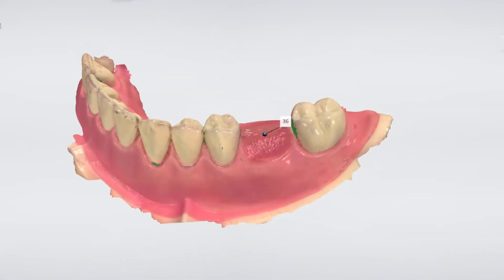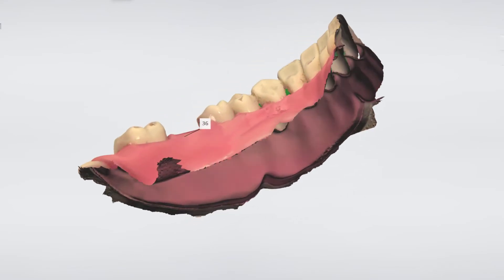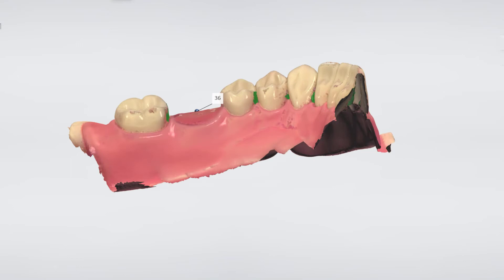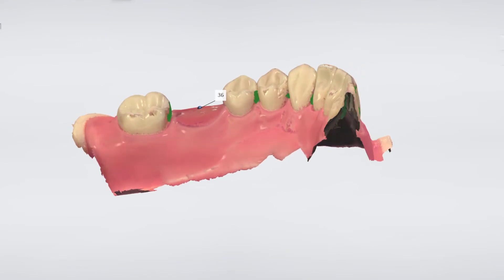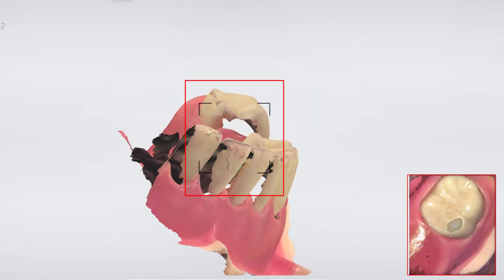Now we have a digital model with enough height on which to stabilize the guide. We also have a good view of the soft tissue, which is important to get a good understanding of the surrounding areas. Please note that for a successful and predictable outcome it is imperative that the implant site and the surrounding areas are fully covered by the scan. If needed, go back and cover the missing areas.